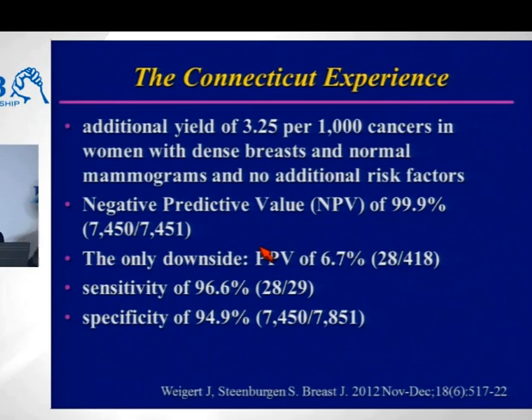Now, these are not high-risk women. These are just women with dense breasts. Normal mammograms, no additional risk factors, with a negative predictive value of 99.9%, which is kind of nice for women to know. The only downside was the positive predictive value, as I explained, is low.